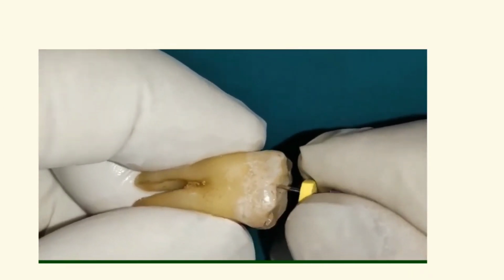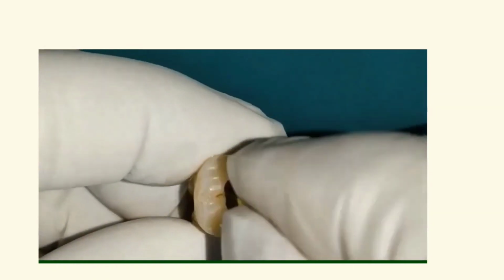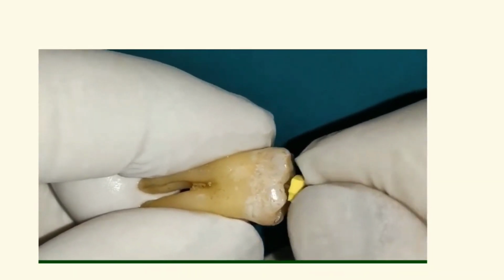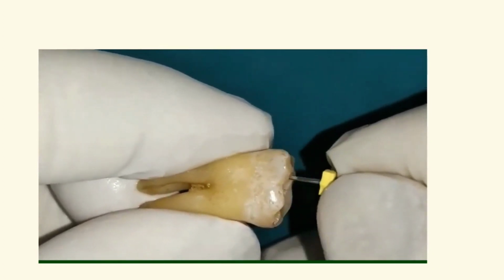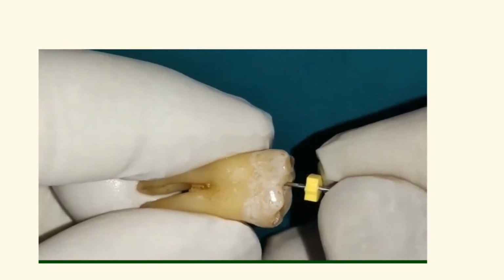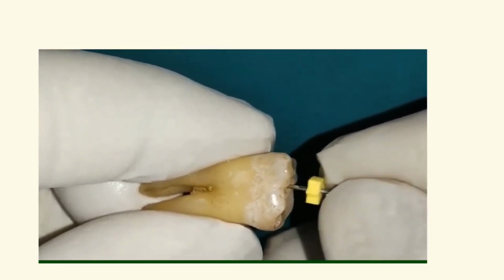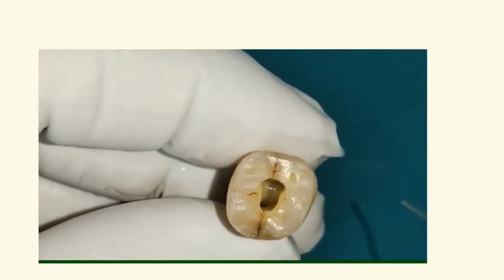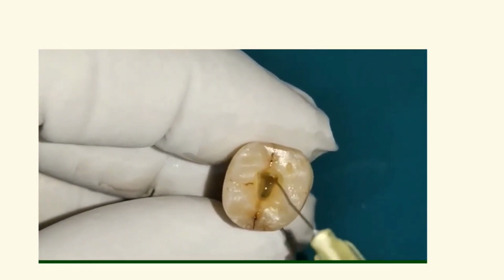Once the file reaches the estimated working length and is a little loose, don't remove it. Now the instrument is made to work within the canal using a small up and down motion, not exceeding more than 2 mm, but always in the presence of sodium hypochlorite. This motion will smoothen the canal walls. Gentle up and down motion, not more than 2 to 3 mm of amplitude.